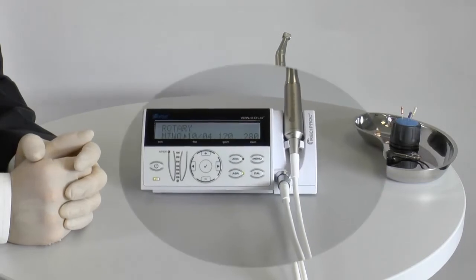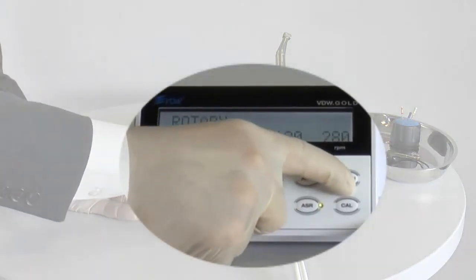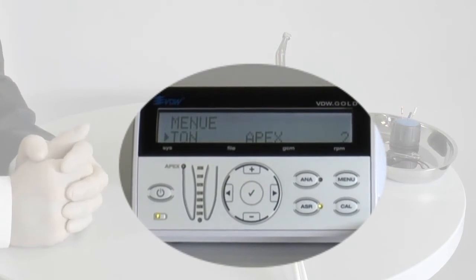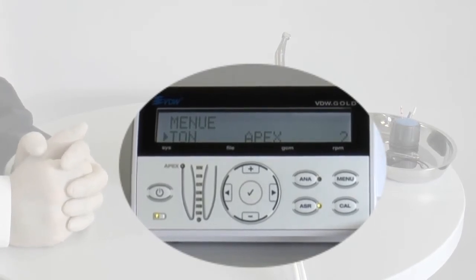By pressing the menu key, you can change settings. Volume for the motor and apex locator warning signals can be set individually.